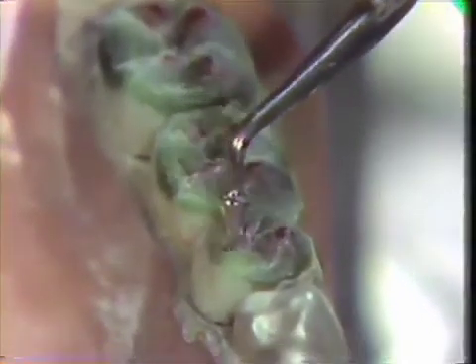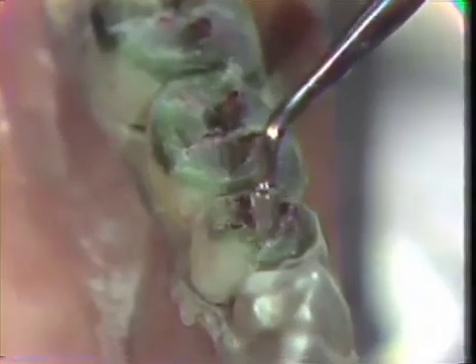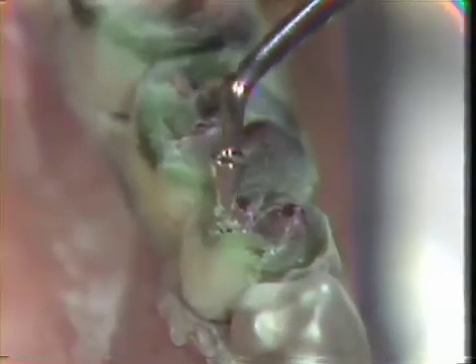These are best developed with the Peter K. Thomas carving instrument and with the Peter K. Thomas waxing instruments, recalling that each one of the developmental grooves is flanked by a supplemental groove. This then completes the anatomy of the tooth. We will now go on to the articulation of our wax-up with the functionally generated stone record.